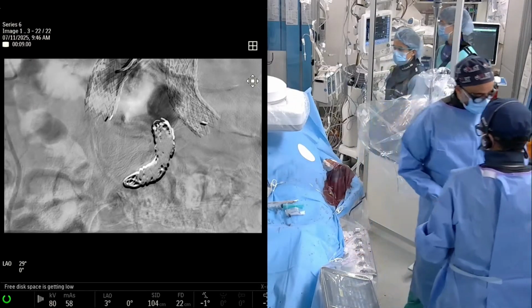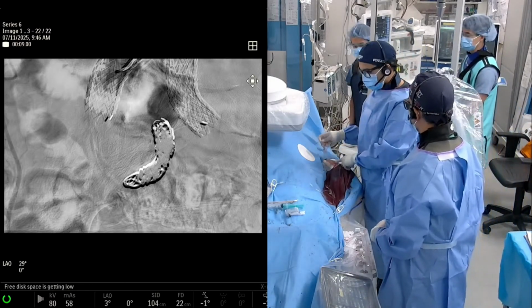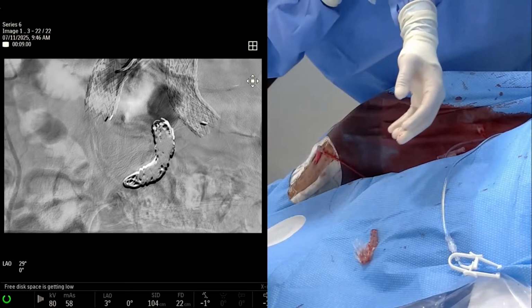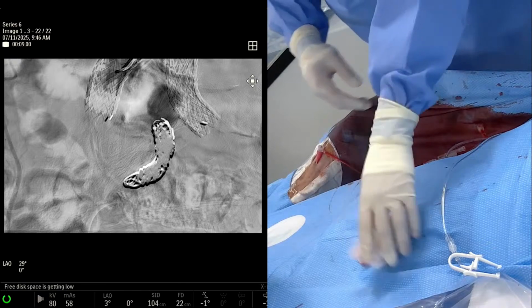It's regular and large. The large, I can't think of any patient who's ever needed something bigger than a large. I've never seen that. Agreed. Large is pretty big. Pretty high up the arm. Unless you get the sheath super high up the arm, which I personally would not recommend doing, just because you have to stay over the bone.